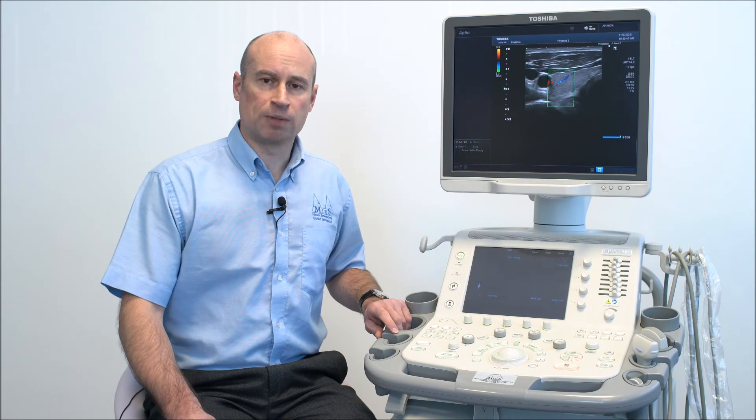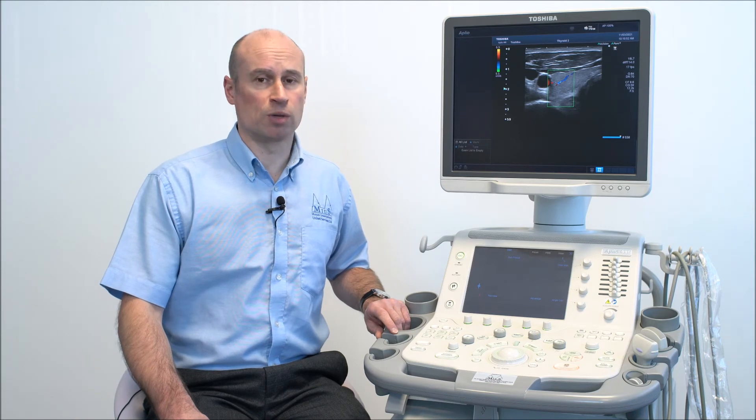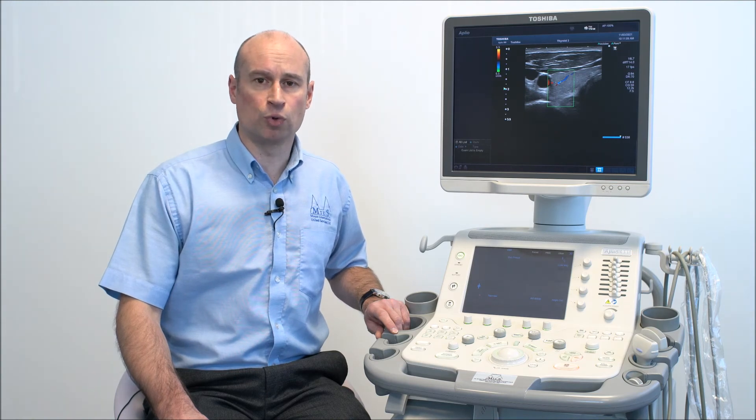All Toshiba Aplio scanners supplied by MAIS will come with full system training for your vets by our application specialist. All of our packages also come with a 12 months parts and labour warranty, with a range of service contract options available for the period afterwards. These range from planned preventative maintenance through to fully comprehensive cover, and can include or exclude probes as required.